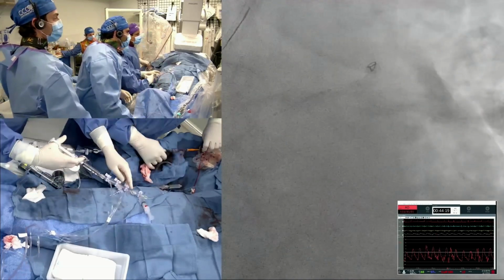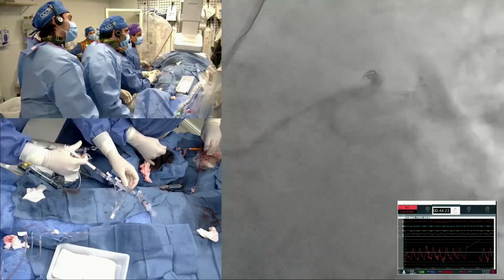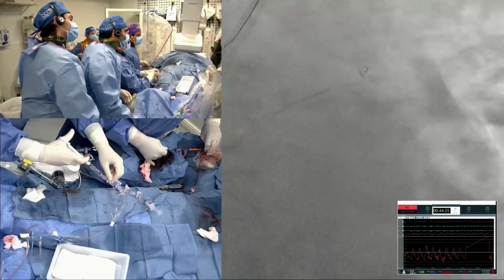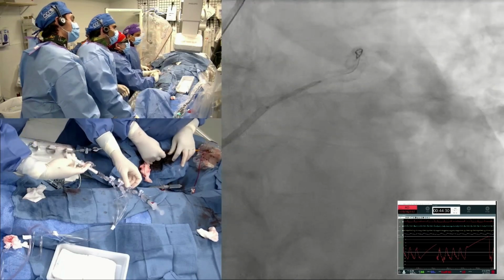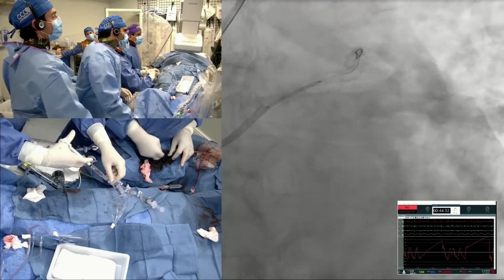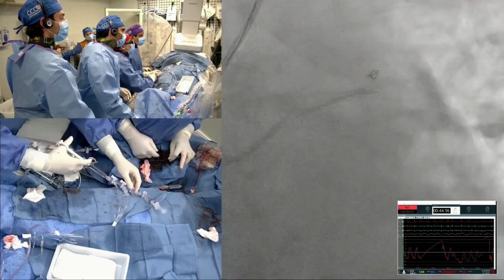Yeah, but George, playing devil's advocate, the IVL is expensive, and if the IVUS had shown you that you already had fractures and you didn't have circumferential calcium, then you didn't need the IVL. I doubt any patient like this one was included in any of the trials. So it's a little bit extreme, the situations we see here.